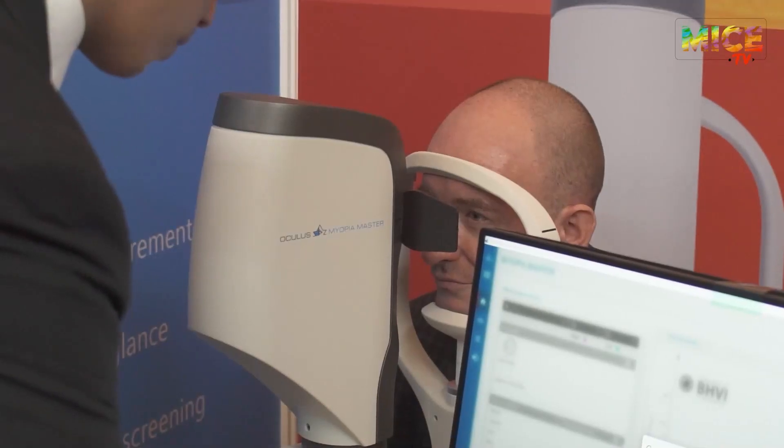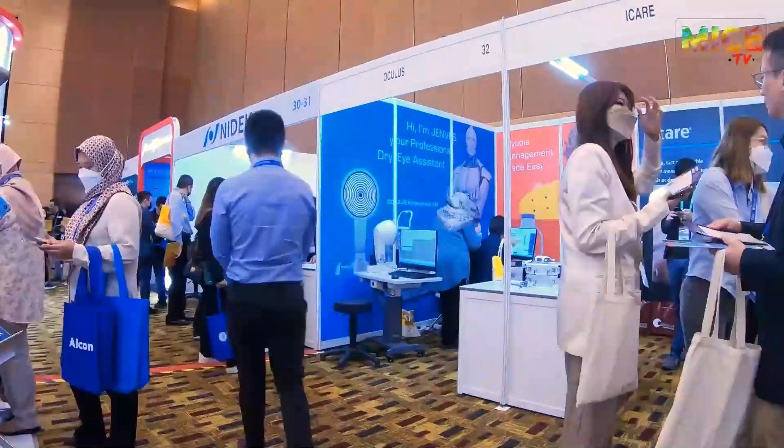Chris, did you happen to see anything today related to myopia diagnostics? Yes, I got to go and do a demo at the Oculus booth where they have the Myopia Master. It offers really accurate data regarding not just myopia as it is now, but how it will progress as you get older. Here at AEOC we've been learning a lot about the control and correction of myopia, but not so much about the diagnosis, so I've come over to Oculus today to check out some of their machinery and how best to diagnose patients for myopia.